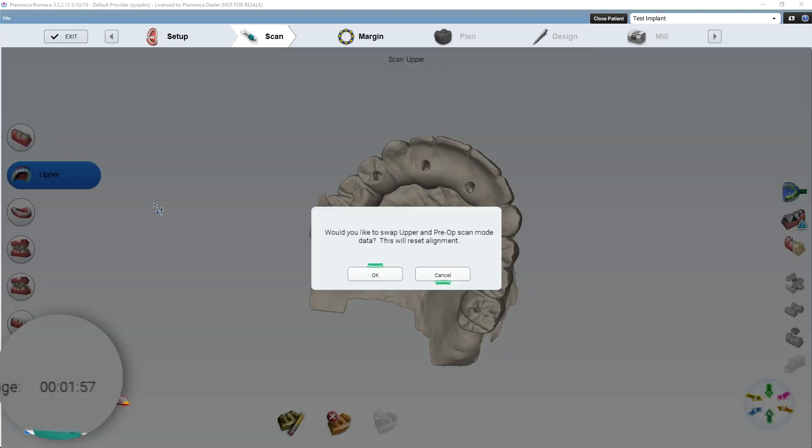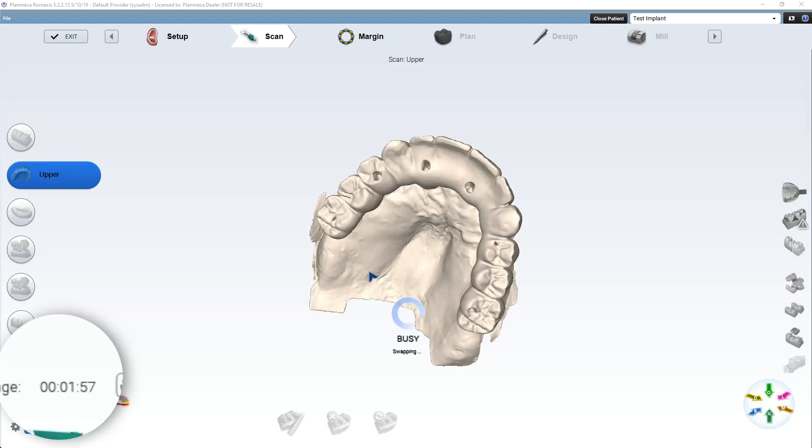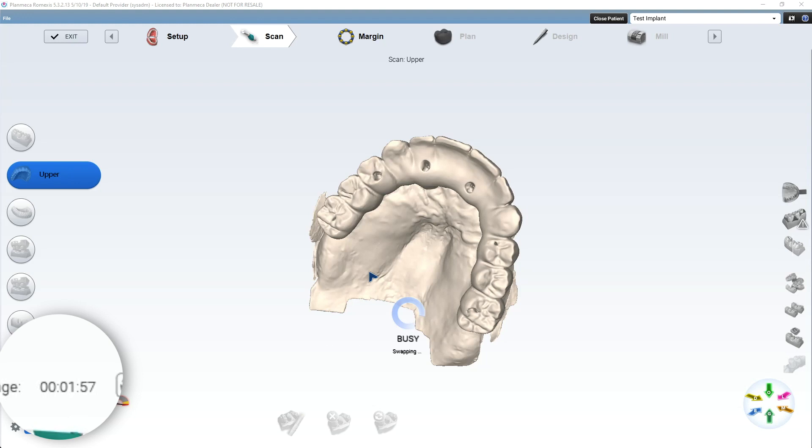Now what I'm going to do is I'm going to copy, I'm going to right click and drag that upper folder to the pre-op folder. So I'm duplicating that model into the pre-op. You could have done it kind of vice versa. You could have scanned in the pre-op and then duplicated down in the upper. But the main thing is that the upper needs to have the prosthetic with the teeth, because that's what's going to be used to stitch the bite.